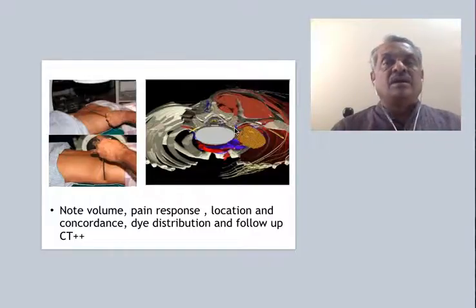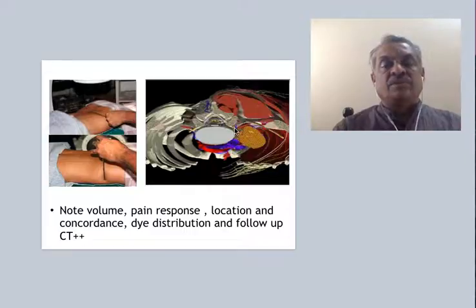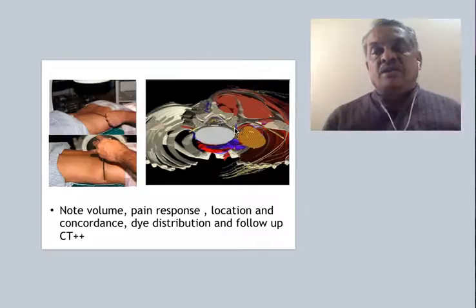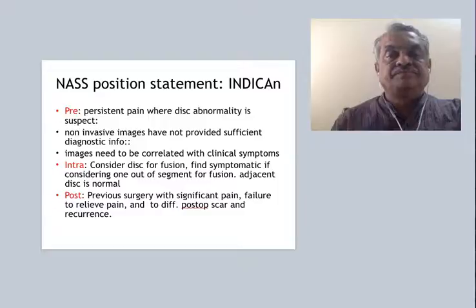And normally in a patient where there is a need to understand the origin of pain and which is not possible through the images alone, then we do a CT discography, that is after the discogram we ask the patient to go for CT, so that we confirm the location of the annular tear and how the disc is behaving and why it is behaving like that.